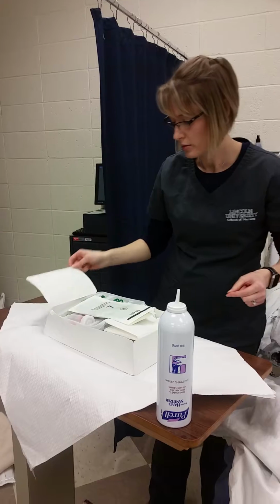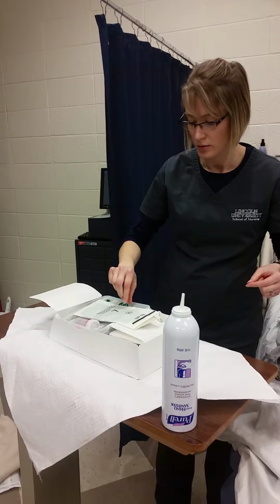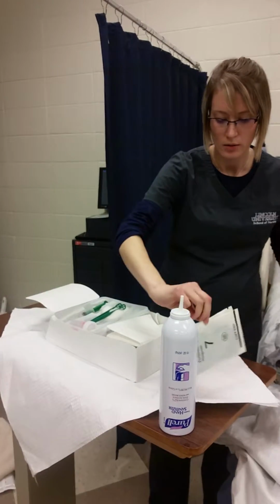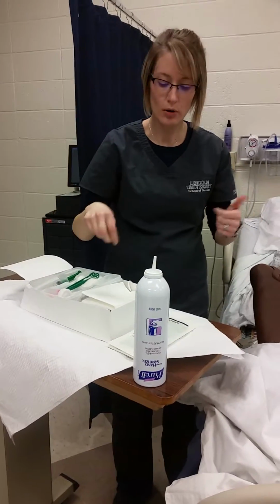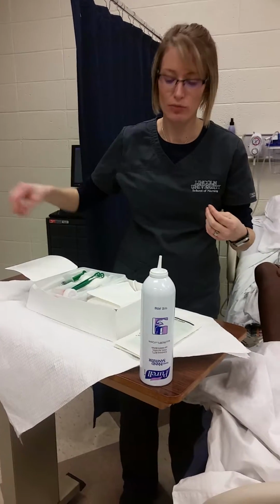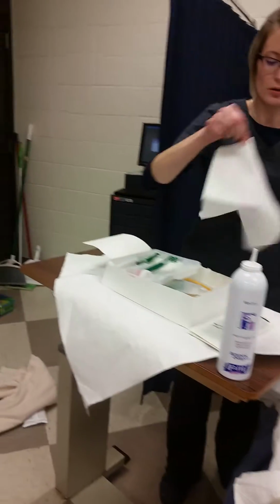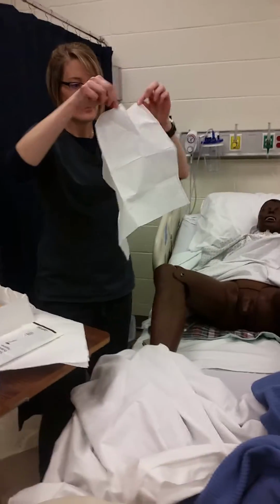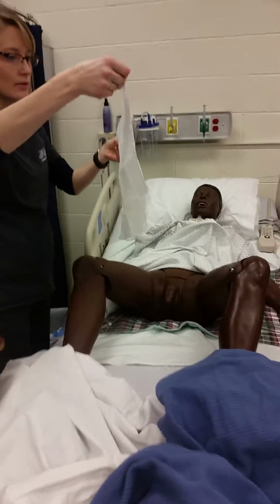I'm going to go ahead and take my sterile gloves out. Now, inside the kit there's usually a triangle drape that you can drape over their penis. I don't use that. I would take that and remove it. I want to take the drape that goes underneath their buttocks and only touch the outside 1 inch perimeter, and the shiny side goes down.